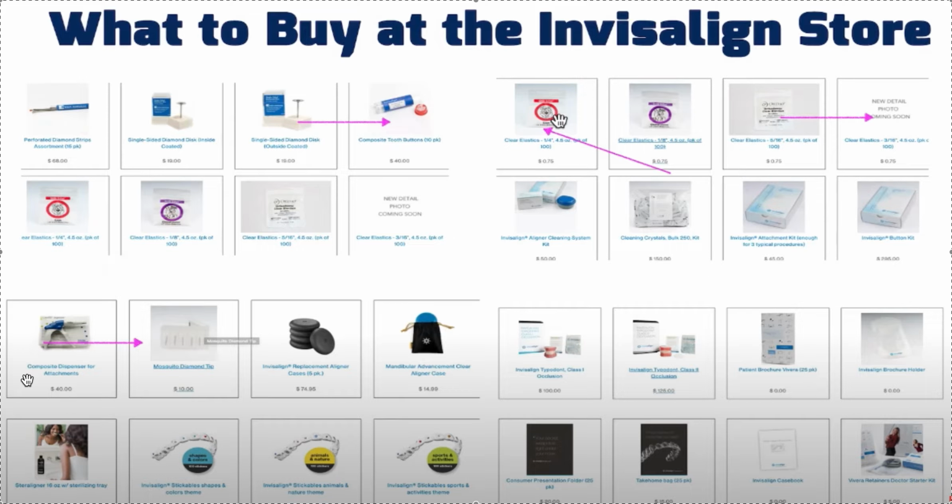Definitely do not use flowable. That's a dumb idea. It makes a huge mess and it's a disaster. Just use regular composite that you use in your practice, but pick a really translucent incisal shade so you don't have to shade match on everybody. But you can use their composite if you want. It's very good. If you don't already have composite in your office, but I don't know why you wouldn't. You can just use your own regular composite. Yeah, pretty much that's it.